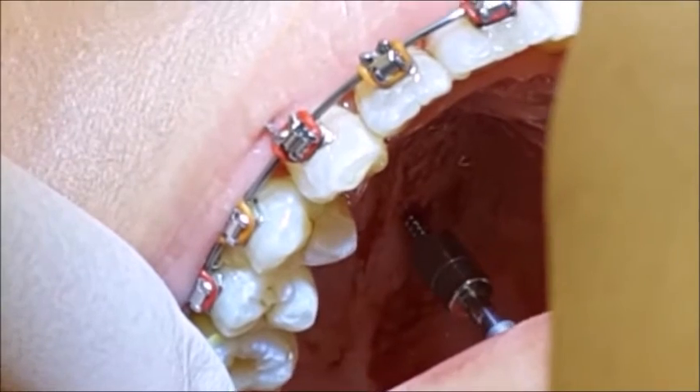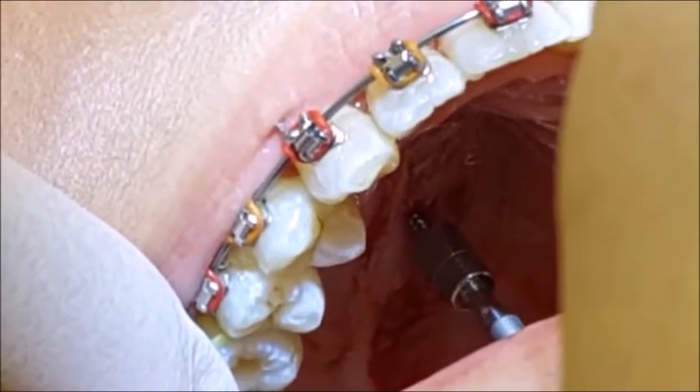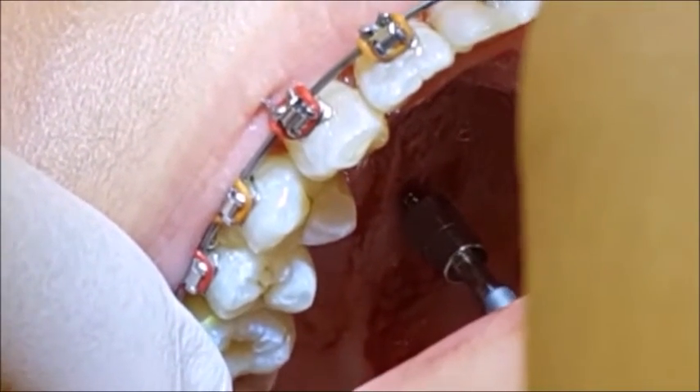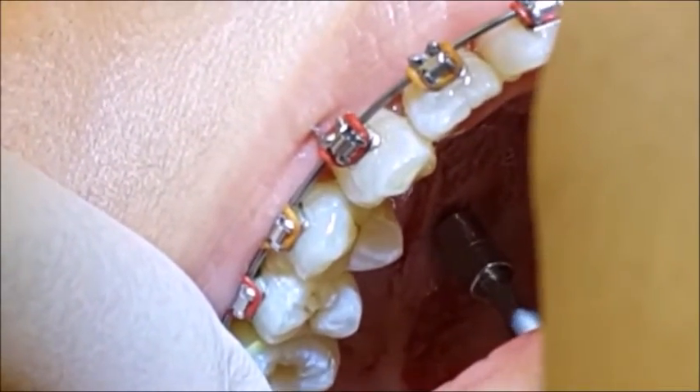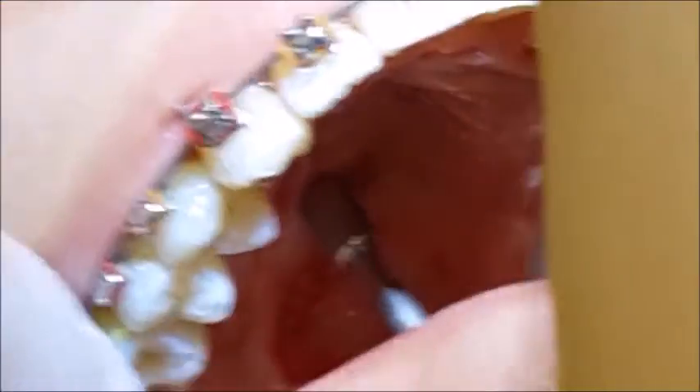There we go - you do not need any pressure at all; just let the pin go in. There shouldn't be any pain for the patient. When withdrawing the contra angle, usually one part comes out first - that's okay, just gently ease it out with your fingers.